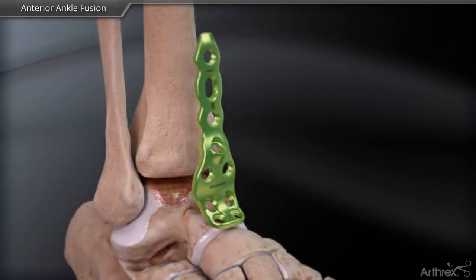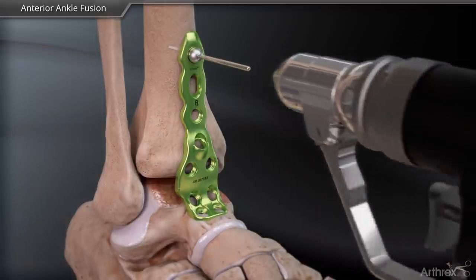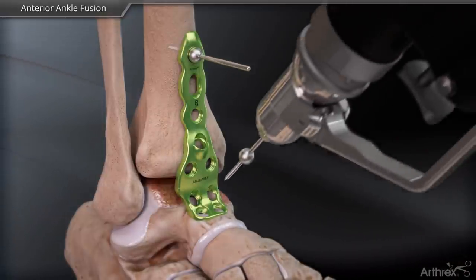Fixate the proper anterior plate across the ankle joint and temporarily fix it in position using one BB-TAC in the tibia and the other in the talus.